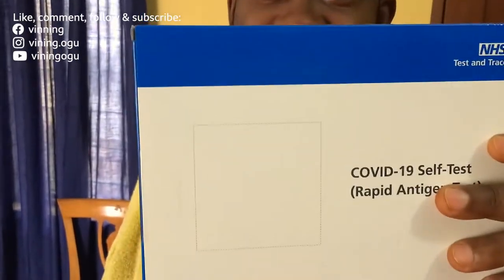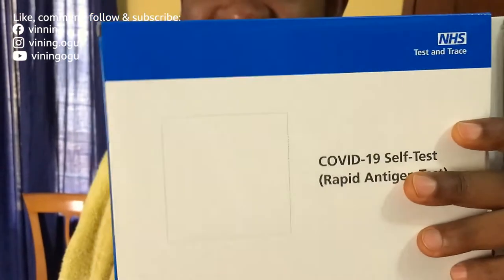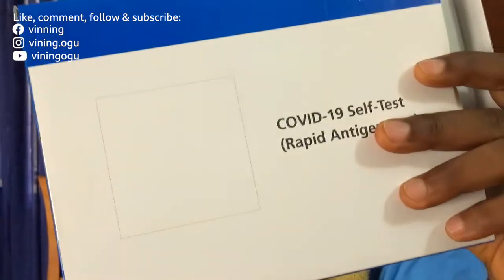We want to do our COVID-19 personal rapid test. We found a kit and we want to use it — I'm demonstrating it. I'm doing the retest for it, it's real.